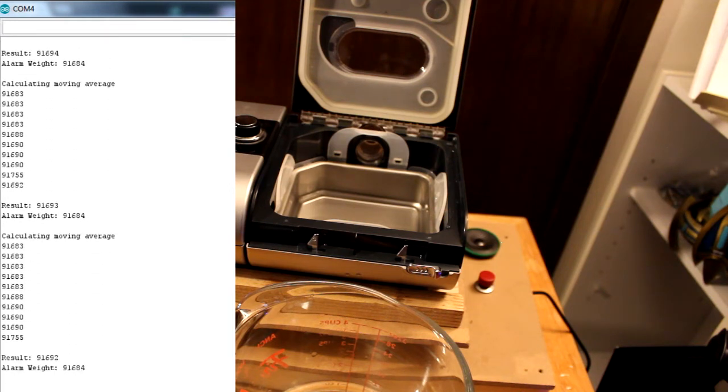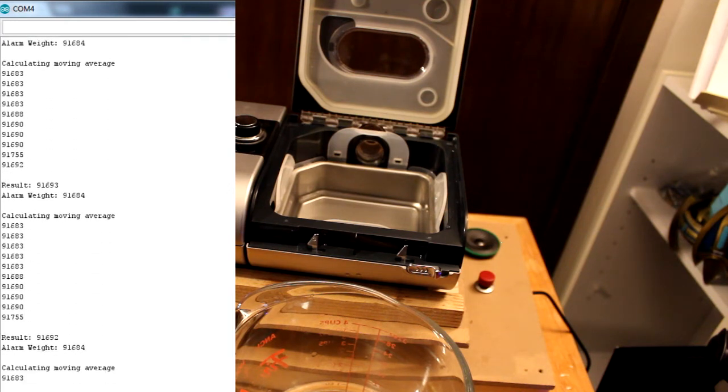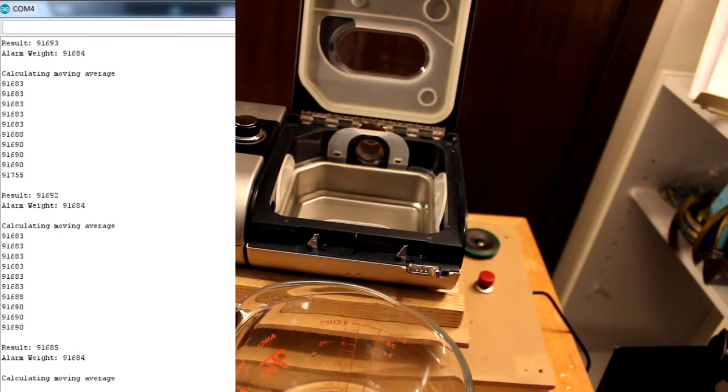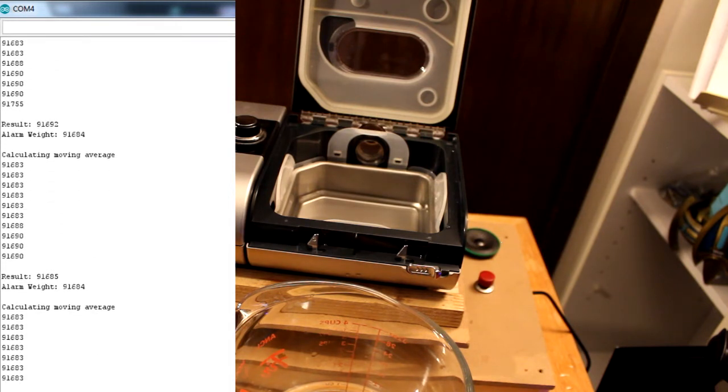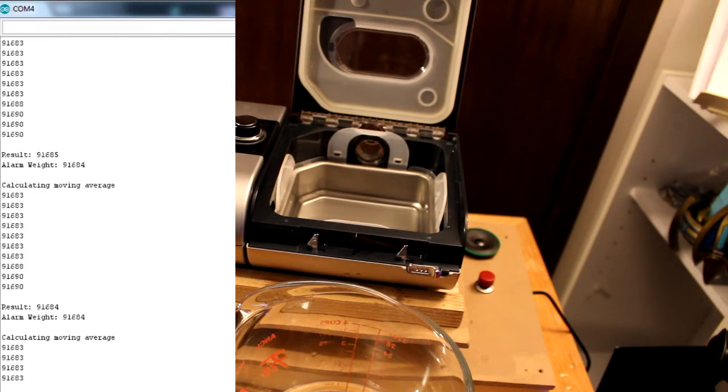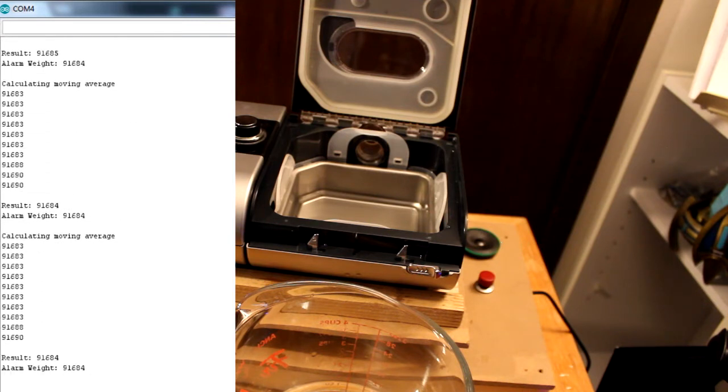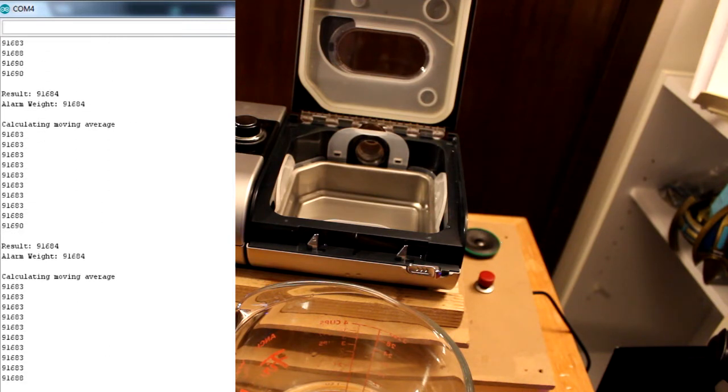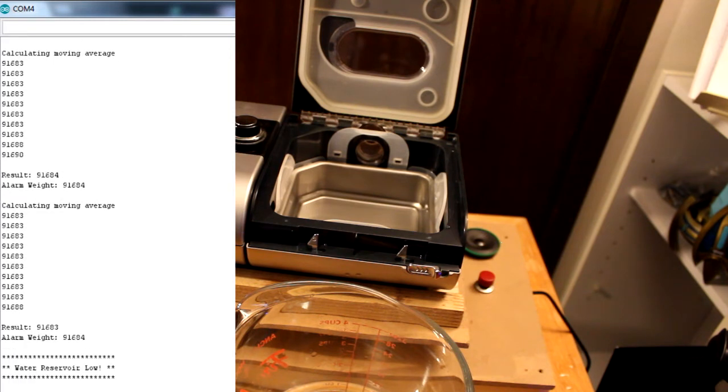The program is set up to sound the alarm with 15% water remaining. The water reservoir holds 400 milliliters, so if the alarm is set for 15% remaining, the alarm should sound with 60 milliliters of water left, or about one quarter cup.